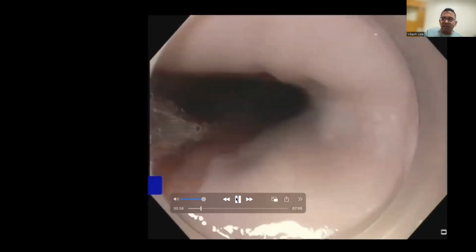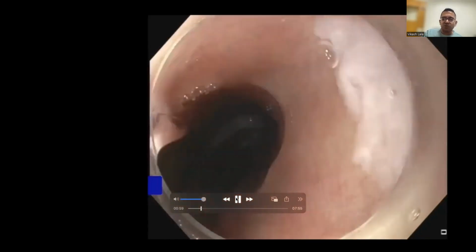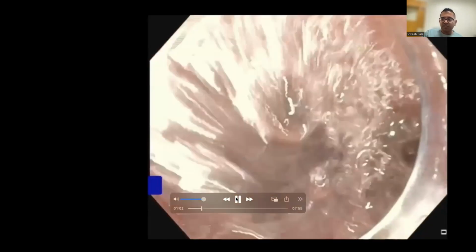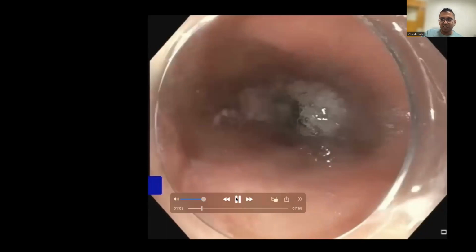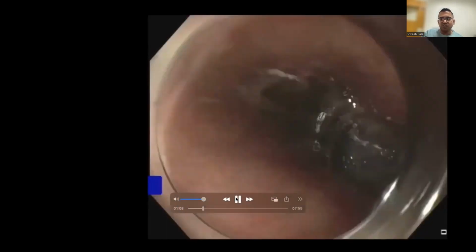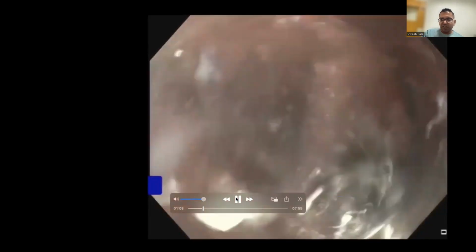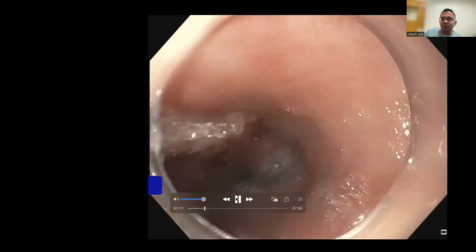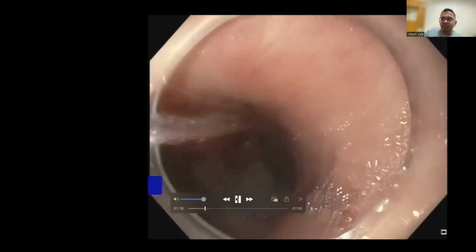And again, the first thing to do is to ensure that your esophagus is clean. Now, just bear in mind that this patient was intubated because I was planning to do an endoscopic resection. And so I was not concerned about irrigating and using water. I was not worried about aspiration. And again, if your water pump is set too high, and if you're irrigating and blasting lesions with the high water pump, you're going to induce some degree of trauma and bleeding, and that makes it very difficult to assess. So don't forget to turn your water jet down when you're washing these lesions.